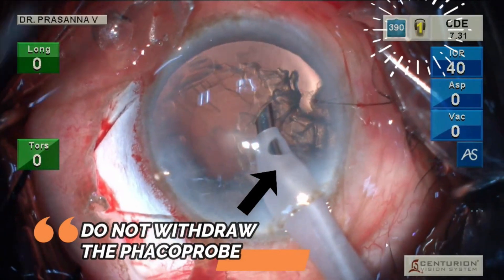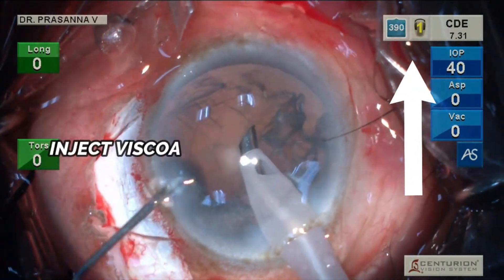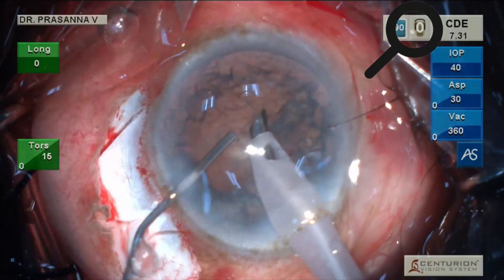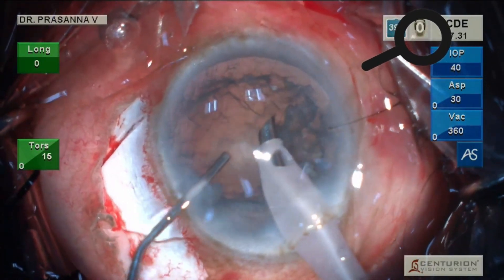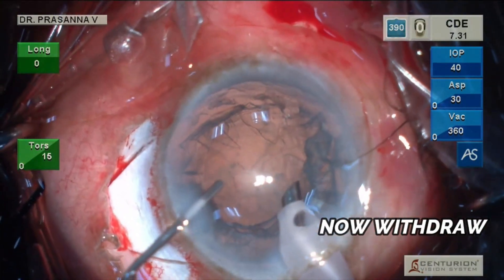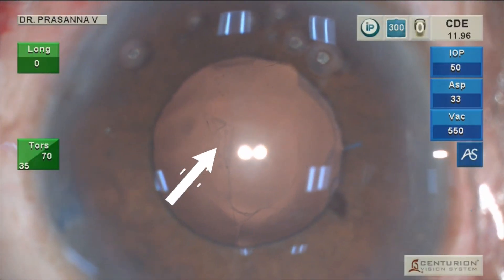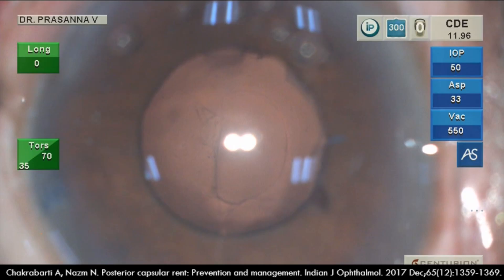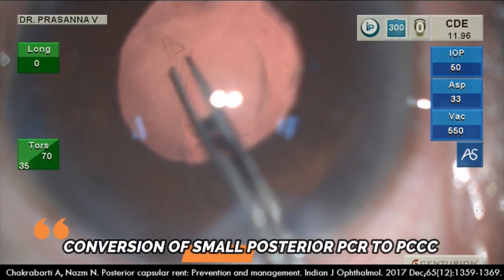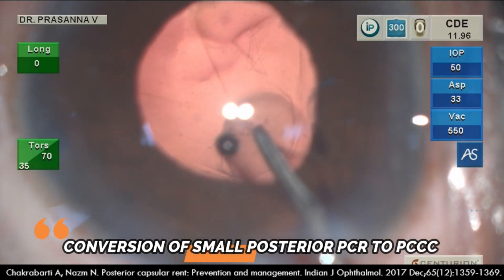Stop and be in foot position 1, i.e. irrigation. Remove the second instrument. Inject dispersive OVD while coming back to foot position 0. It is crucial to follow this sequence as it will prevent further vitreous prolapse. We followed this and prevented enlargement of PCR in this case, and performed a posterior capsulorrhexis to contain the PCR.